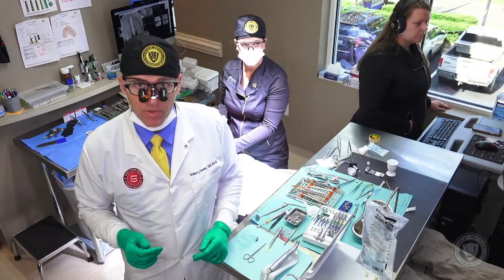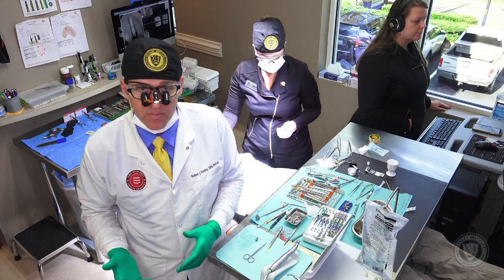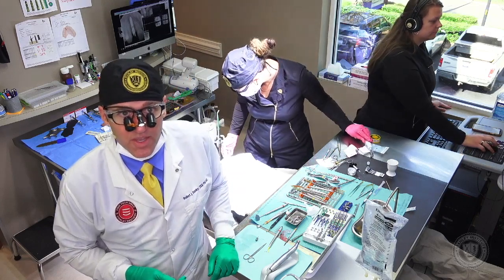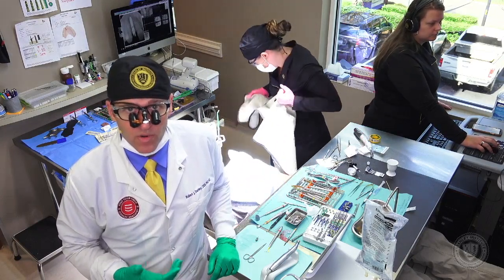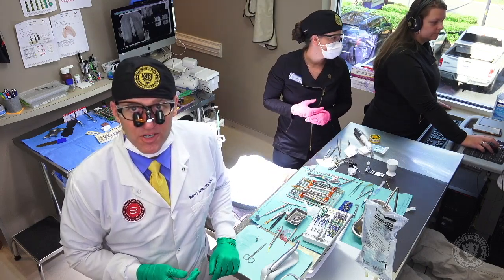We've got a beautifully placed crown on top of an abutment, on top of an immediate implant, with a veneer graft that should last a long, long time and give great results. We'll let them wear this for about three months and then come back, do ISQ, verify that looks good, and then start the final prosthetic workup for them. Thank you so much for tuning in — look forward to seeing you next time.